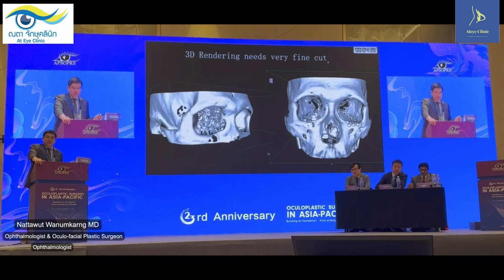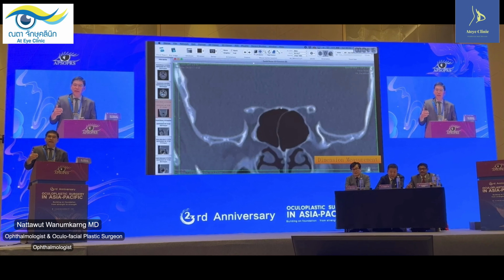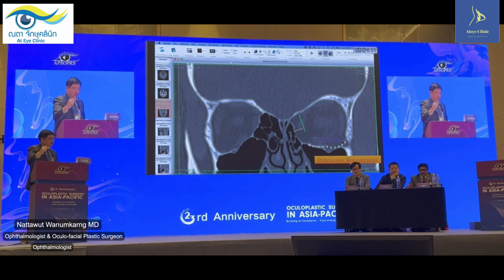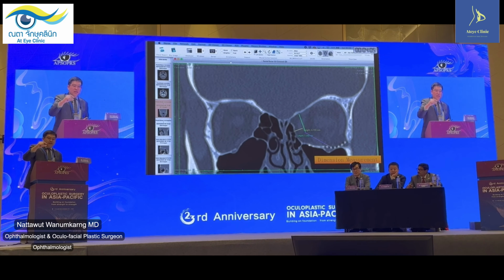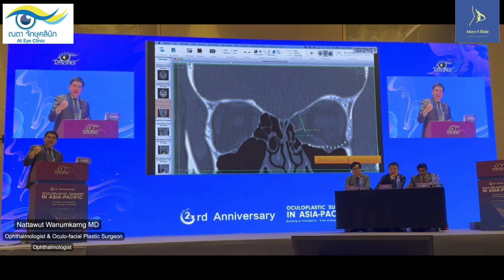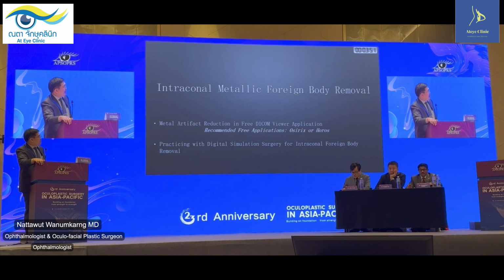And it's very good for the presentation also. For the dimension measurement, one of the modes used for measuring lets you see how many millimeters of the bone are broken, how many millimeters of the bone dropped, and you can bend the implant before the surgery. In the old days we just went in and cut, put in, put out, put in, put out. But nowadays we do more customized, patient-specific implants.